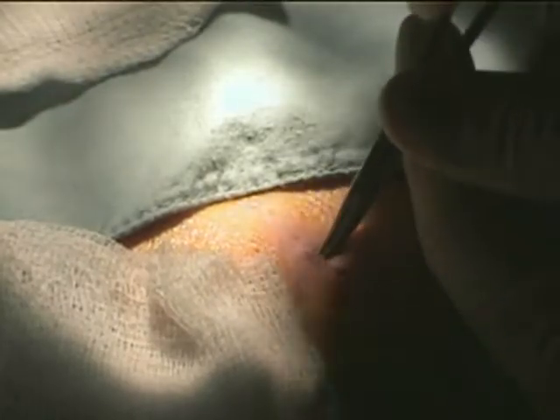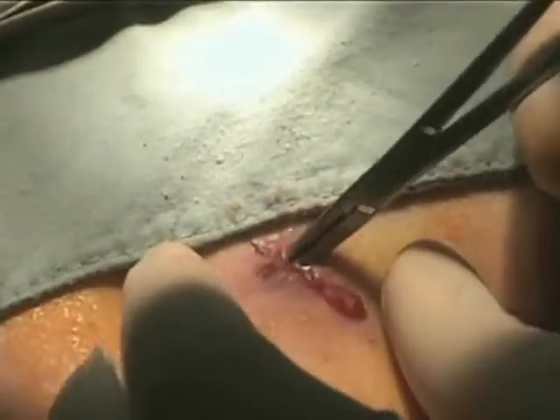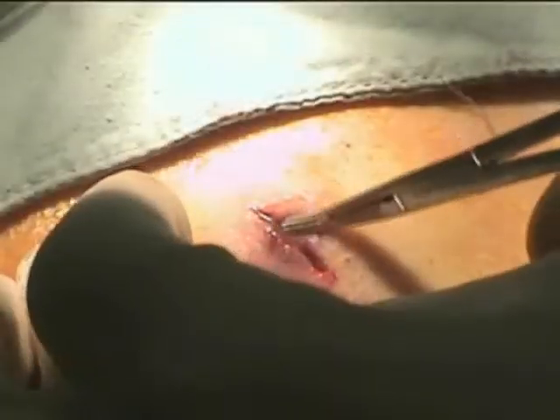Explore the abscess cavity thoroughly with a sterile cotton-tipped applicator or with hemostats. Attempts should be made to break down any walled-off pockets or possible septa.